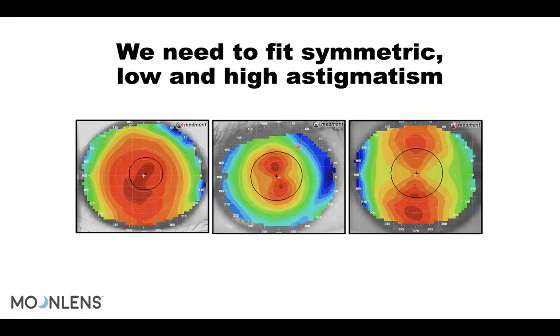And if you see this, you're gonna know, okay, maybe a symmetric lens is gonna work. Like I was telling you, Randy Kojima, based on studies made at the Pacific University, has told that about a 30 microns difference between the flat and the steep meridian is going to lean more toward a toric design.